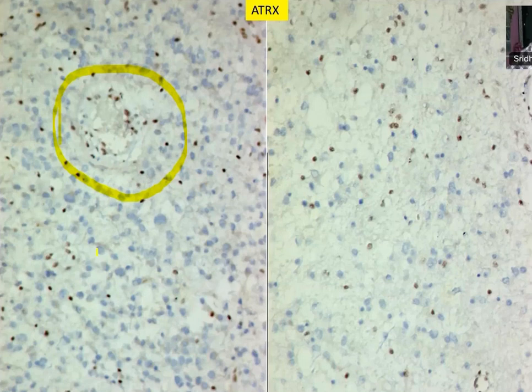You can see the tumor cells are ATRX loss. So what does it tell you once ATRX is lost? What does it mean? It's an astrocytic. It is not an oligodendroglial tumor. It's definitely an astrocytic, your impression of astro. At this point, what is your diagnosis? Will you be able to add any more?